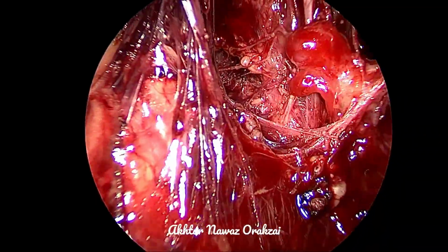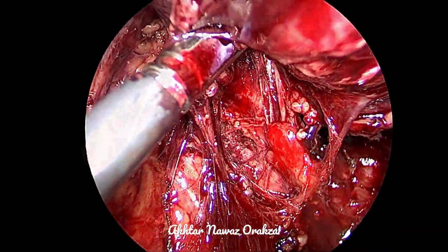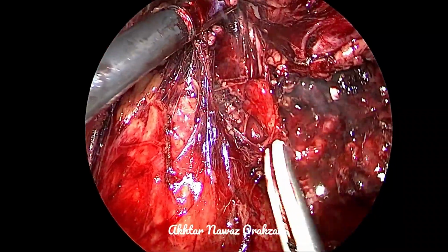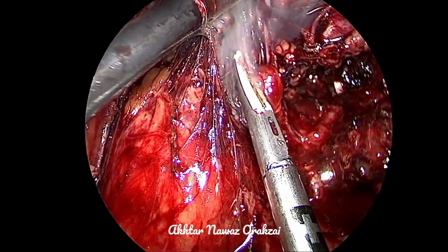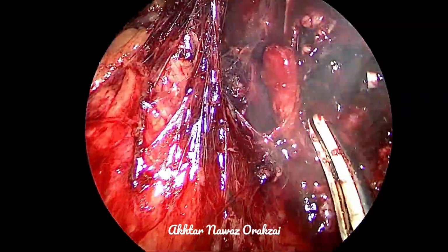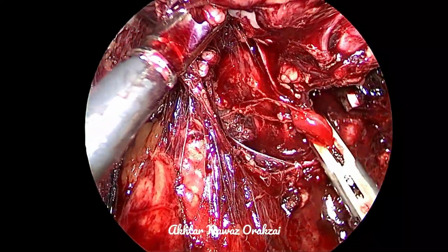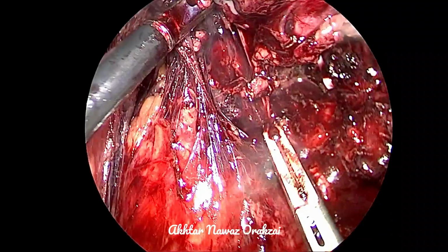So on the screen you can see with the arrow the position of the renal artery. We dissect away the small lymphatics with the suction, and then once the atmosphere is clear and the visibility is good, we are using the vessel sealer, the ligashore, to dissect the tissue around the adrenal artery.